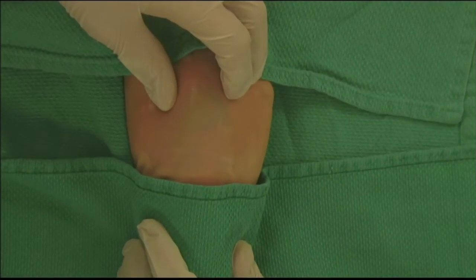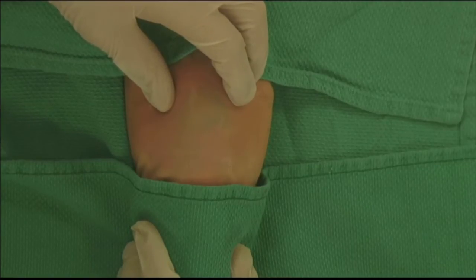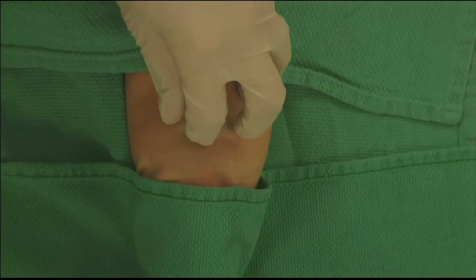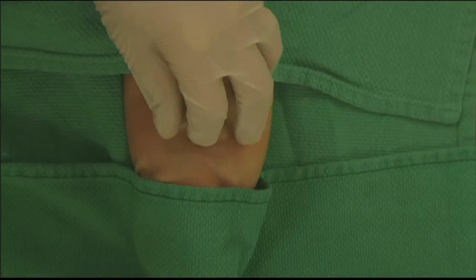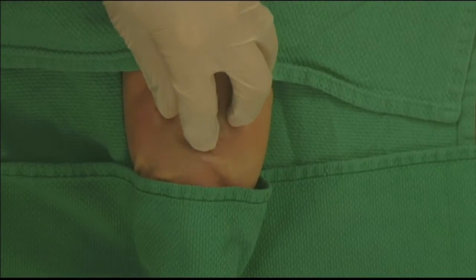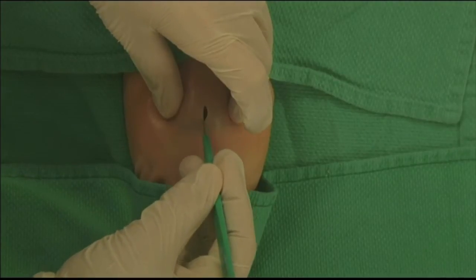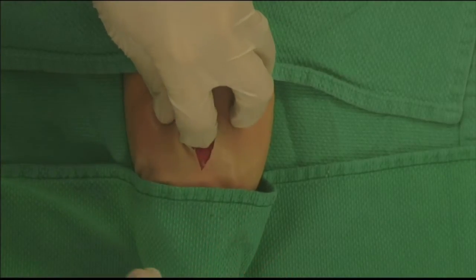Now we're going to walk step by step through the open bougie crike technique using a pig trachea model. As a right-handed operator, I will be standing to the patient's right, using my non-dominant left hand to identify midline structures — feeling the thyroid cartilage, doing a full laryngeal handshake, to get a good sense of where midline is. That's the key in this procedure.